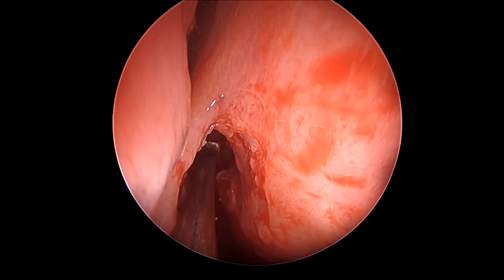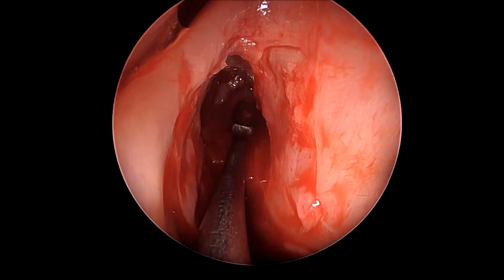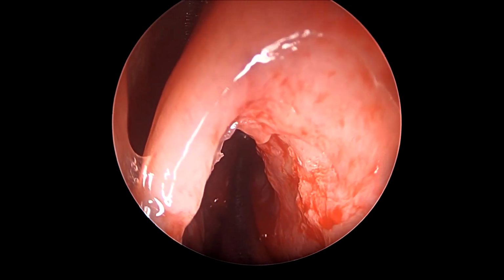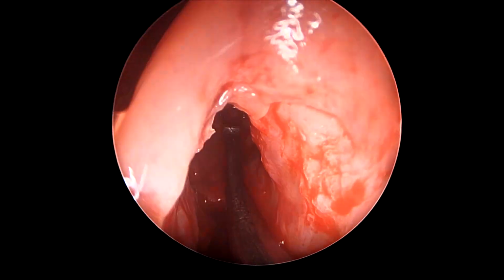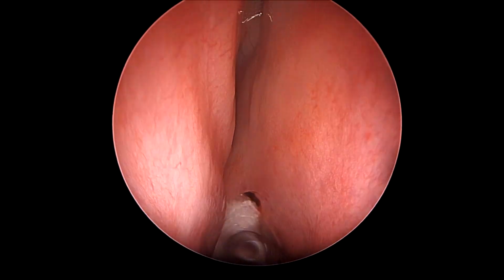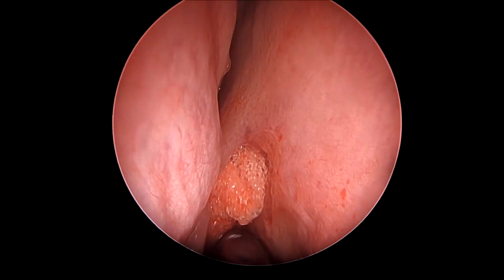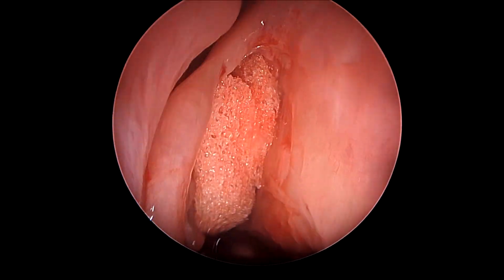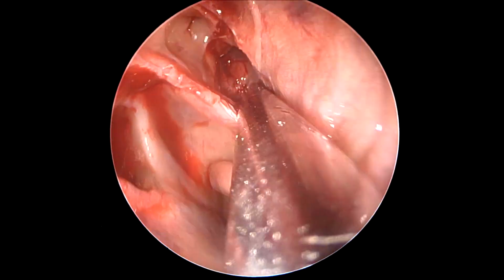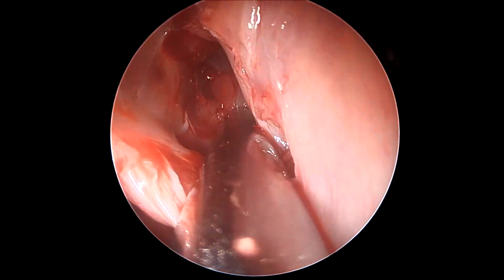As you can see, the inferior two-thirds of the party wall between the bulla cell and the frontal sinus have been removed, with a slight superior one-third still remaining. And sometimes it becomes a little difficult, without drilling the bone of the frontal beak, to get the instruments that high up. So as long as we are sure that our access to the frontal sinus is adequate, that one-third of the bone sometimes could be left as well. In an attempt to remove that, one mustn't cause more trauma collaterally towards the septum and the lateral nasal wall, because that could lead to scars, adhesions and eventual synechiae formation.